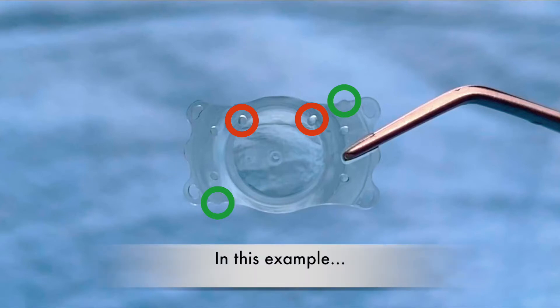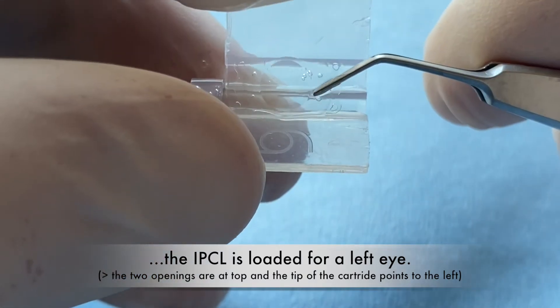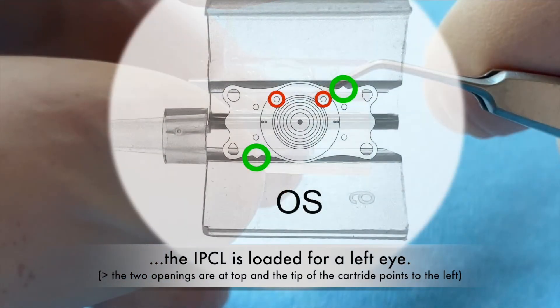In this example, the IPCL is loaded for a left eye. The two openings are at top and the tip of the cartridge points to the left.